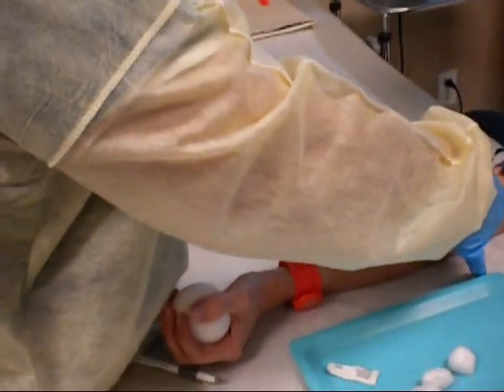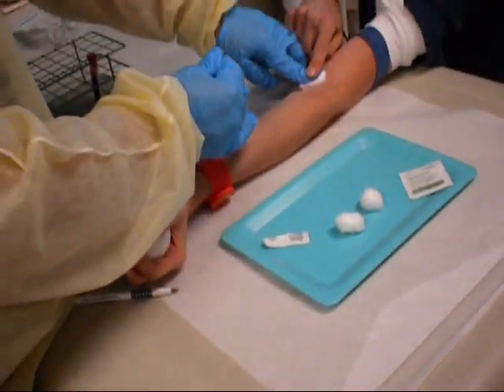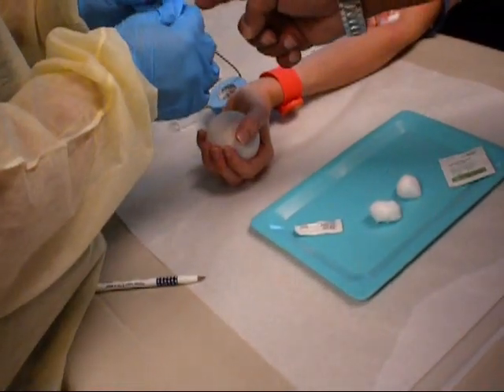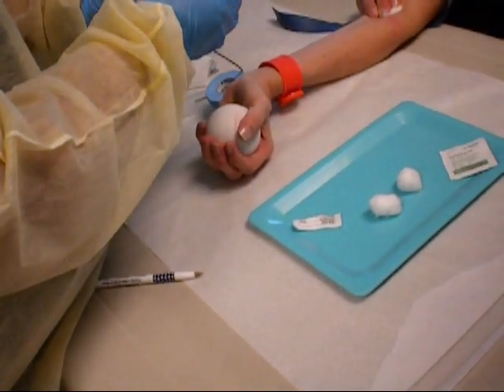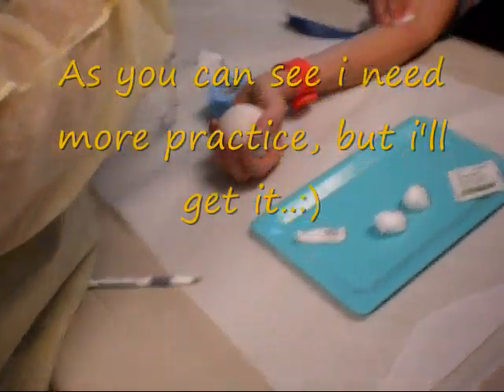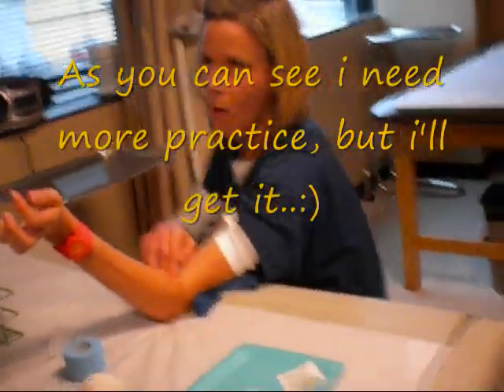Thank you, Joy. We all thank Joy for providing the blood for him today. You're going to wait until it stops. Don't push down, just right there. Now I will hold this and you put the safety on. Hold the yellow part with one hand, hold the two with this hand, and pull in the two. There you go. Congratulations, you've drawn your first ounce of blood. We put that in the sharps. Hold it. See that?